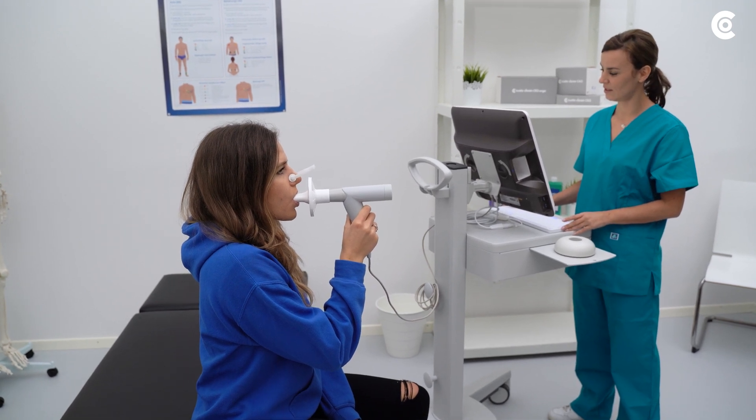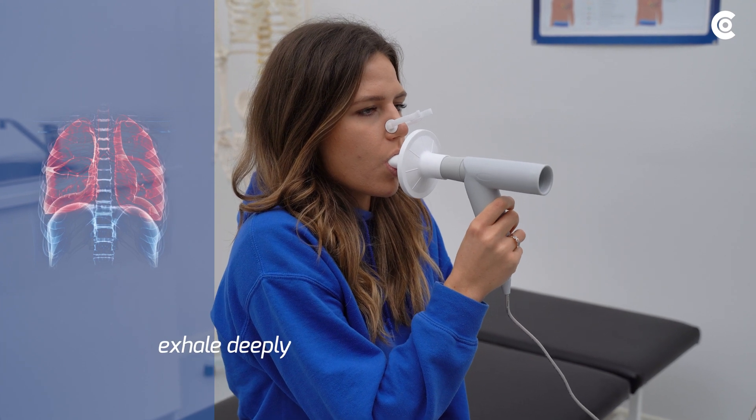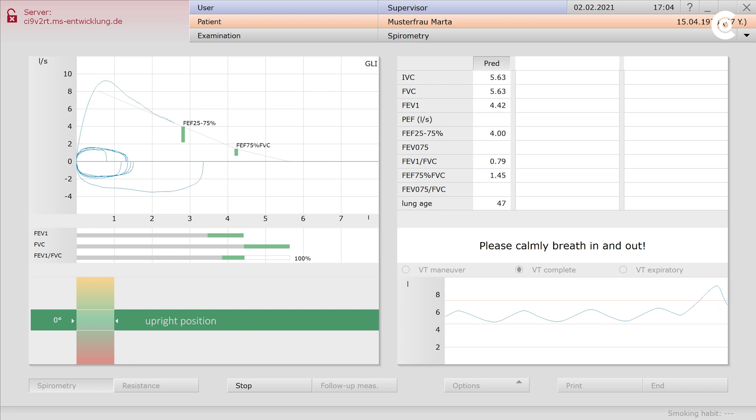You can now start measuring. The patient should exhale as long as possible between tidal breathing and the breathing maneuver. If they have only exhaled half-heartedly, the patient will not inhale enough during the subsequent breathing maneuver.